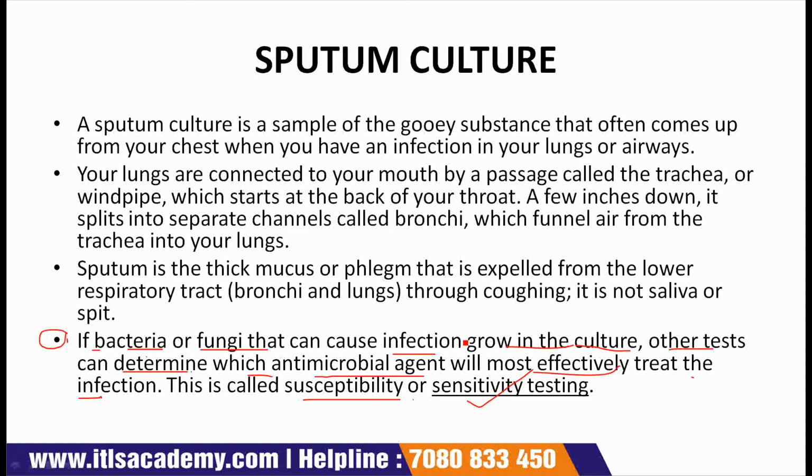Such pathogens include Streptococcus pneumoniae, Haemophilus influenzae, and the highly infectious Mycobacterium tuberculosis, which are transmitted by inhaling aerosols. For this reason, laboratory processing of sputum for respiratory pathogens is performed with the aid of a biological safety cabinet.